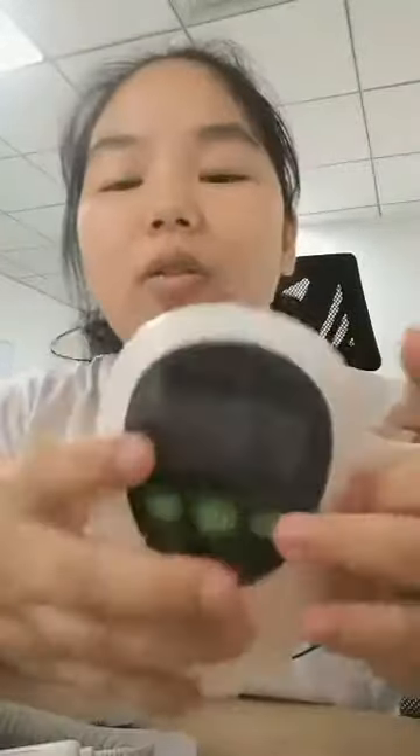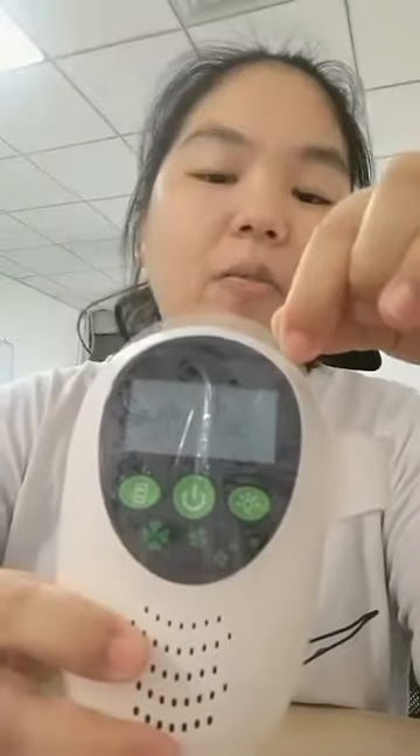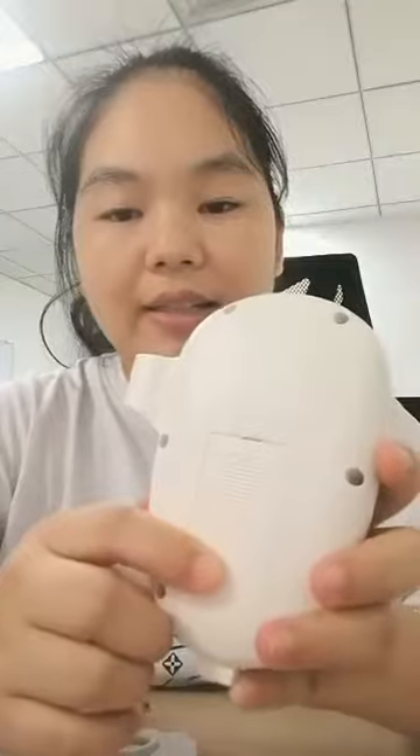Before using, you need to remove this protective plastic film and insert the two AA batteries at the back side.